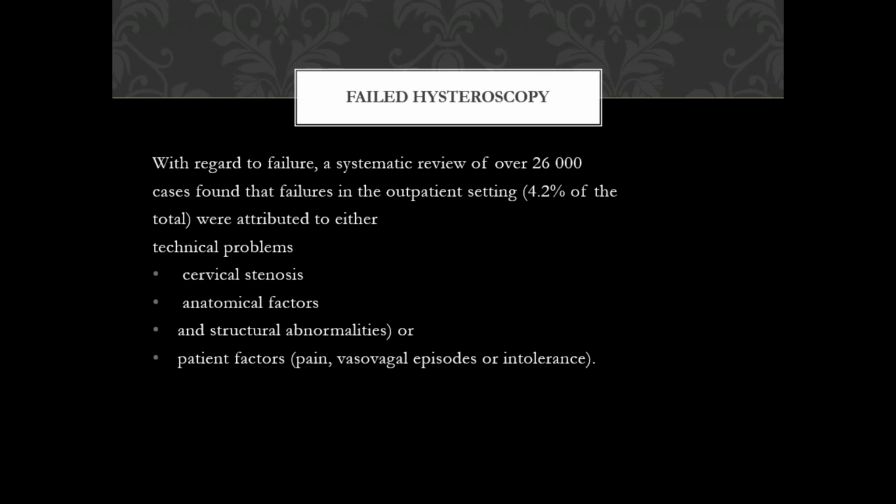The last thing you may have some information about is the Essure contraceptive method using hysteroscopy. The Essure is very effective. The success rate may be up to 98 to 99%. A metallic device is inserted through the hysteroscope inside the ostia bilaterally to block the tubes and then prevent pregnancy.